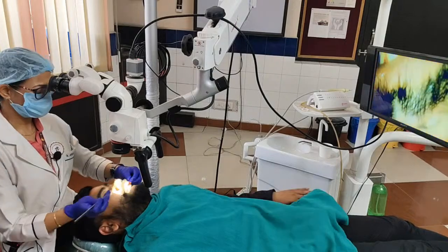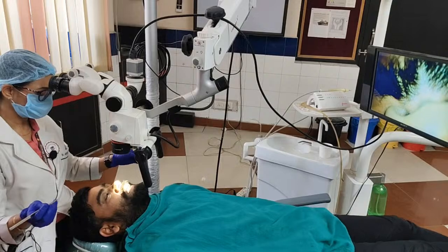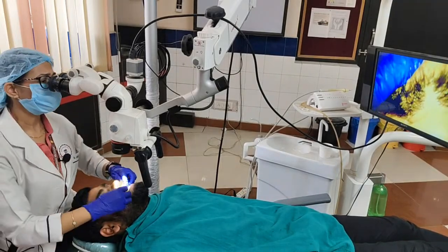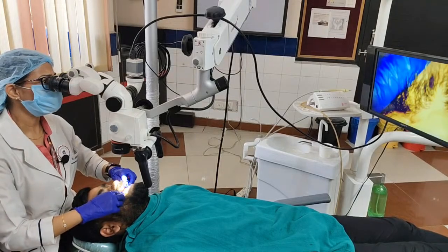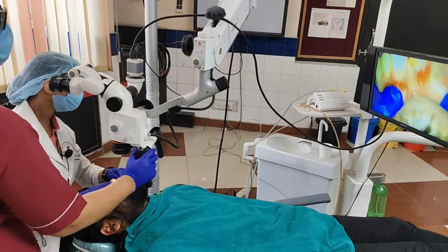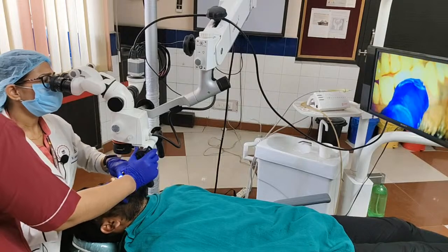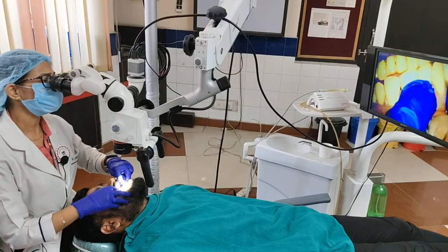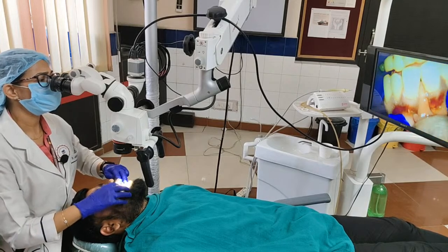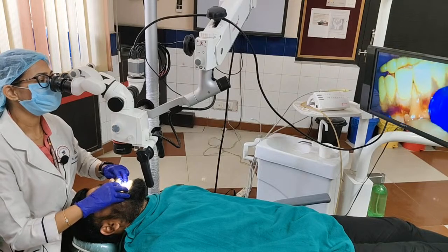Just give me a second. See, if I were to show you a non-treated area, can you see that shine? Now it is not visible. It is out of the field of view. Now, can you see this area? It is shining. The epithelium has a particular shine. It reflects light. But when you see here, there is no reflection of light. That means the epithelium is stripped away. Can you see that?